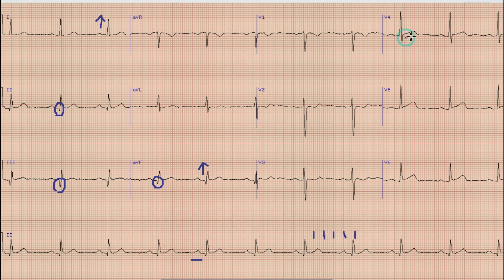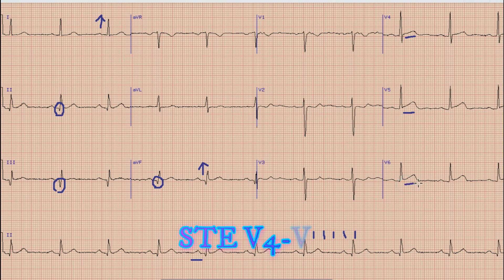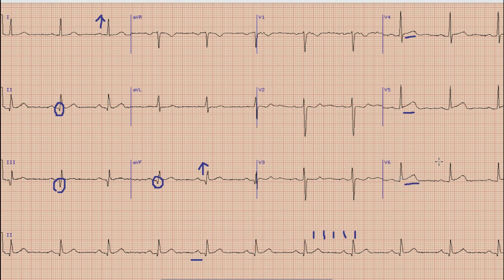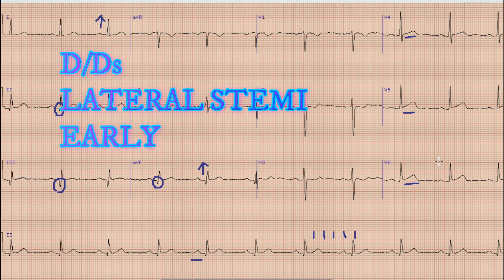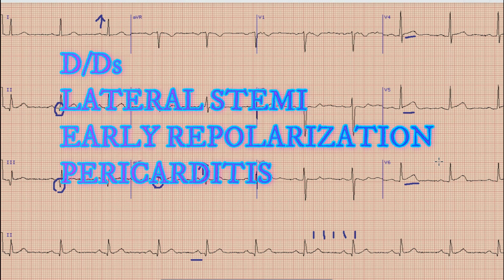Another significant finding which you can see on the ECG is there is 0.5 to 1 mm ST elevation in leads V4 to V6. Now with this kind of ST elevation there could be three possibilities: one is lateral ST elevation MI, secondly there could be early repolarization, and there could be possible acute pericarditis.